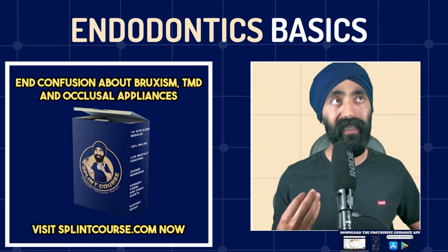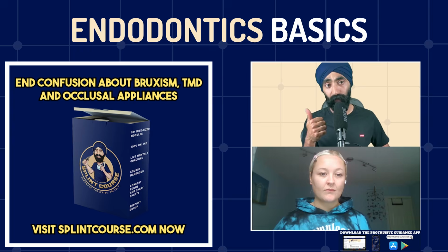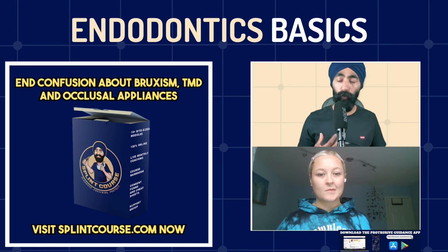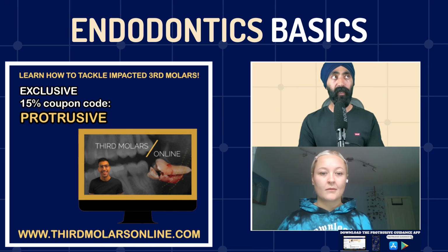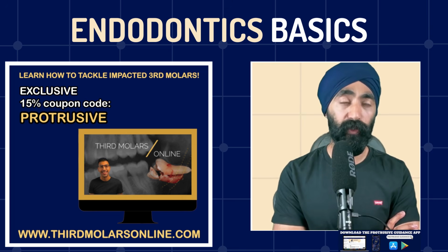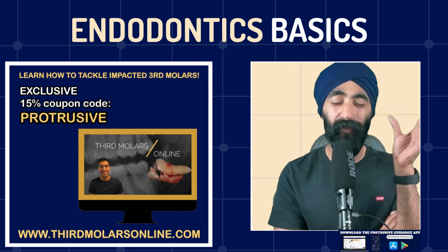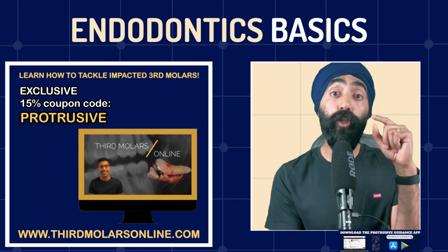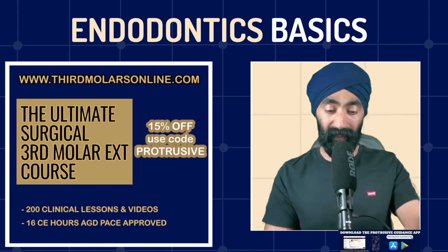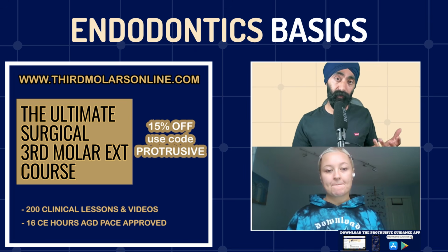But the thing is, when you see a radiograph, the radiograph cannot tell you whether rubber dam was used, whether hypochlorite was used, whether the coronal seal was really that good, and what protocols were used in terms of disinfection. So yes, the radiograph is one factor, and if you look at the European guidelines, the GP code, the obturation should be within 2 millimeters of the radiographic apex, I believe. I need to revisit these guidelines again. And then there should be no unfilled canal beyond the GP. Let me say again, there should be no unfilled canal beyond the GP, and that's a really good one to look for. But again, these are just a factor, right, which don't tell you the full story.